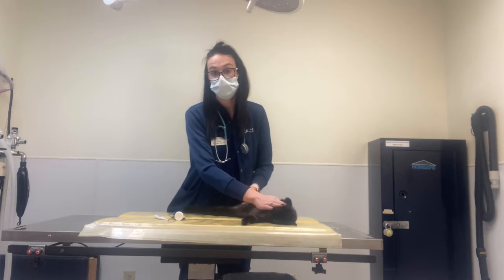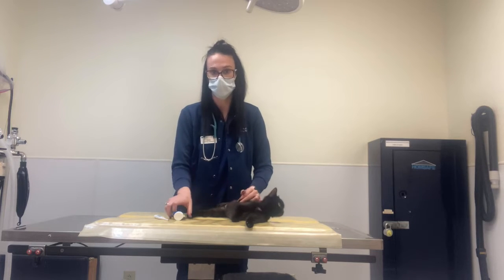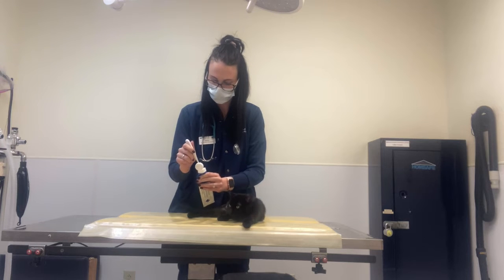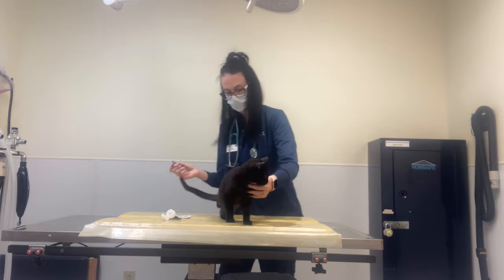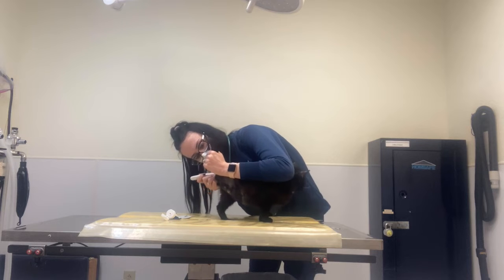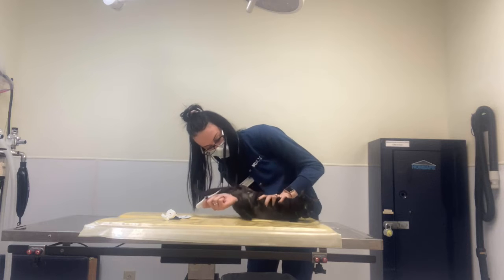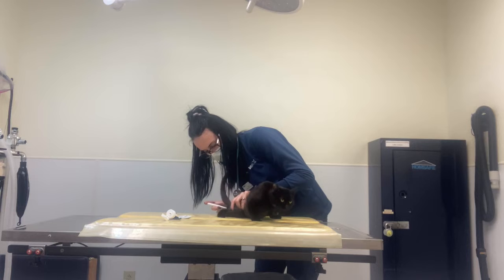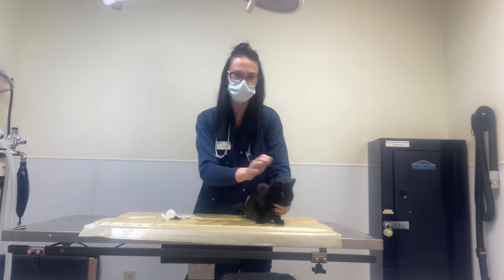And we're going to attempt to take a temperature rectally, but most of the time we need help with that, so I would need another pair of hands. Come here, girlfriend. I know. Hang on, come here. Want to roll over? There you go. Hang on, Venus. Okay, she's not going to let me do her temp without another pair of hands.